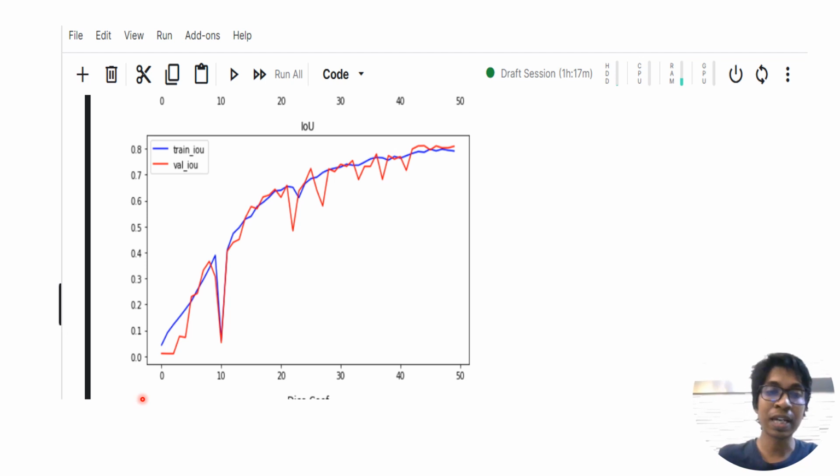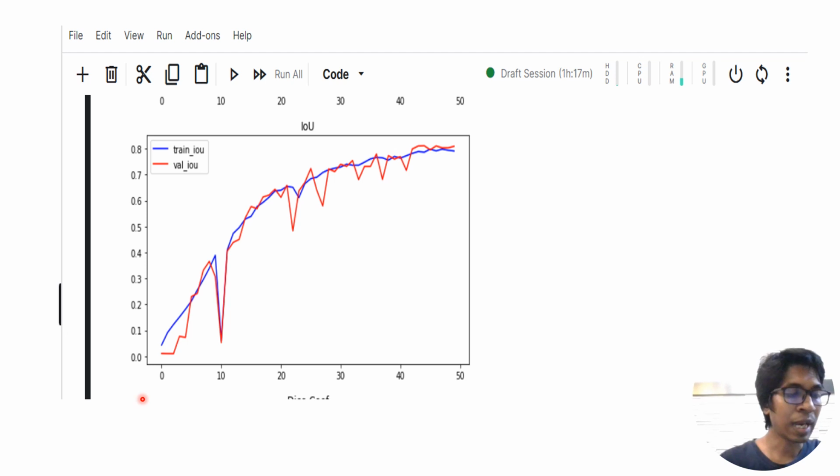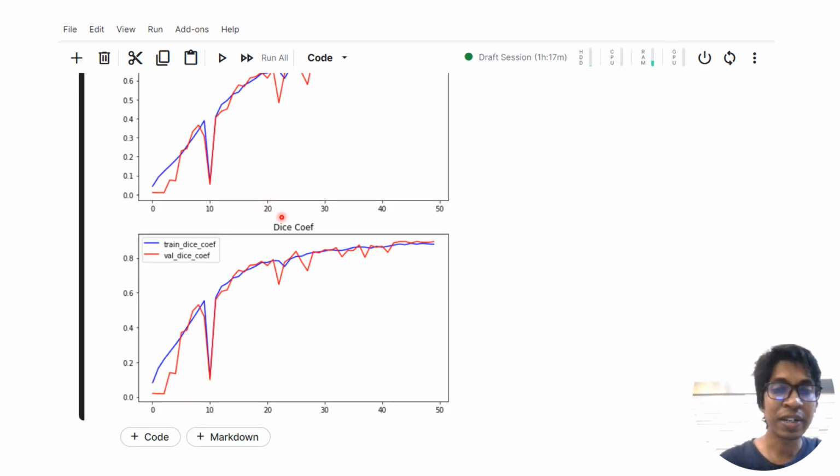This is another metric for our training, the IOU, intersection over union, among the images, checking whether there is any affected area. Another coefficient we chose for this study is the dice coefficient, the similarity coefficient, a spatial overlap index and a validation metric.